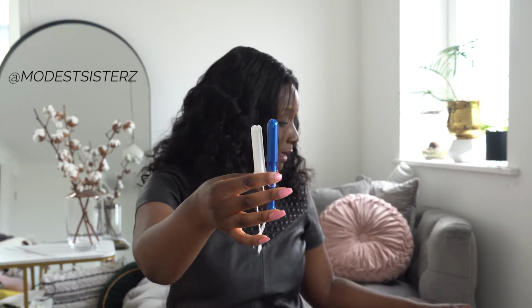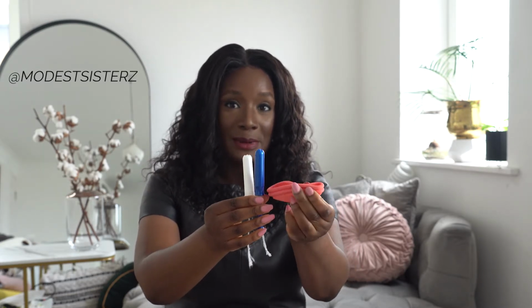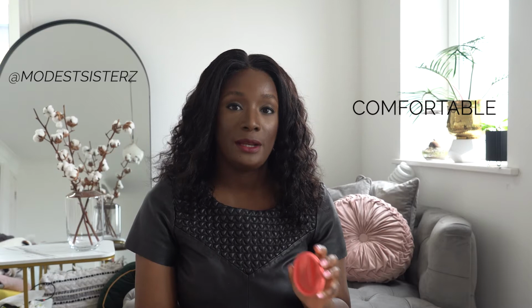Okay, so these are 2 medium tampons, and this is the Nixit menstrual disc. In comparison, I keep it in here. You insert the menstrual disc folded like so. You actually do it bit by bit, and then you hook it up. In terms of it being uncomfortable to put in, the reason why this has worked for me is because it's been way more comfortable and way easier to put in than the cup, than the OrganiCup, the Saalt Soft Cup.